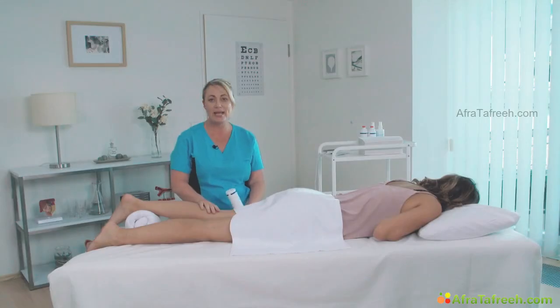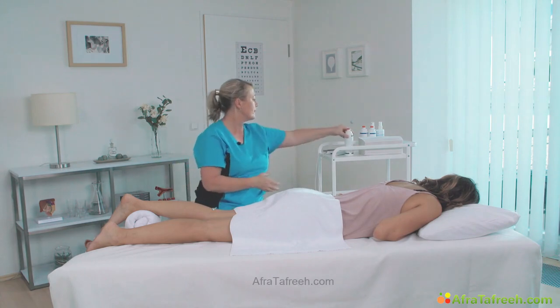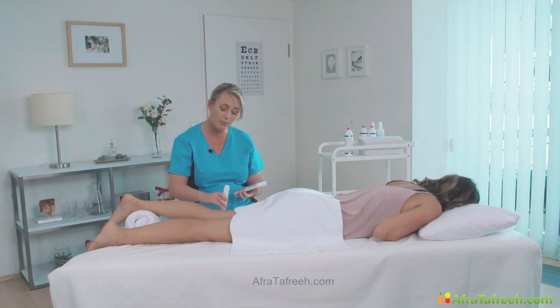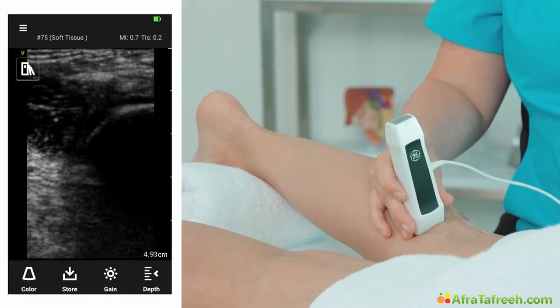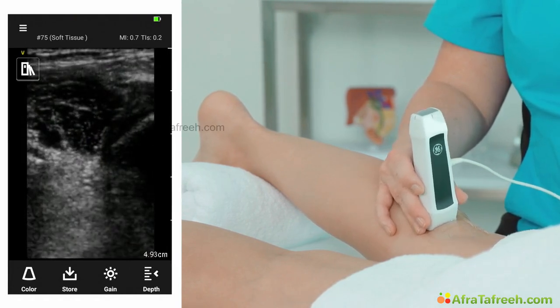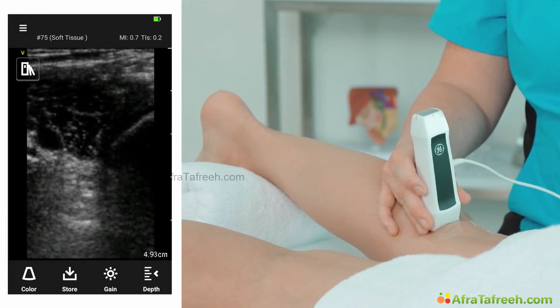For the remaining knee musculoskeletal scanning, we're going to have a look at the popliteal fossa to see if there's any Baker's cyst, as well as at the posterior knee joint for any fluid. Place some gel on the knee. Place our transducer in a transverse plane, again with the marker pointing towards me, at the knee crease. We're going to slide our transducer slightly medial to identify the femoral condyle again as our bony landmark, and then just superior and in the middle of the image there now we've got the gastrocnemius muscle or tendon.